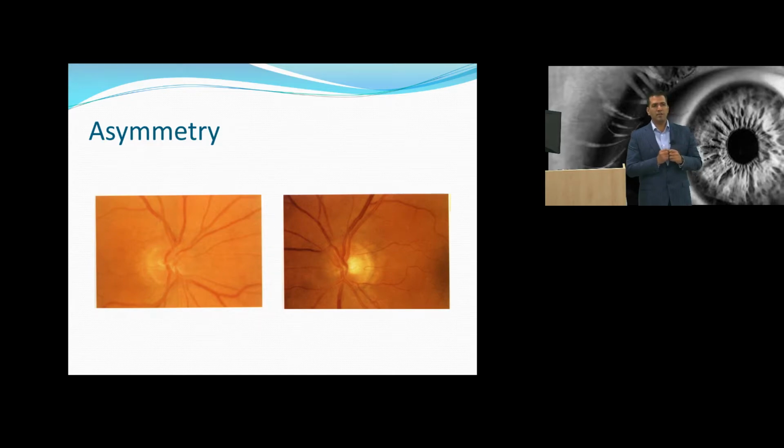A clear way to measure the size of the nerve head is by actually using a slit lamp reticule, and what you find is that you can actually place your indirect lens in front of the eye, and you can adjust the height of the beam, and you measure a number. And depending on the lens that you utilize to view the fundus, you can get a value of the vertical dimension of the optic nerve head. It's crude, but it's pretty easy to do, and once you do a good few patients, it becomes second nature.